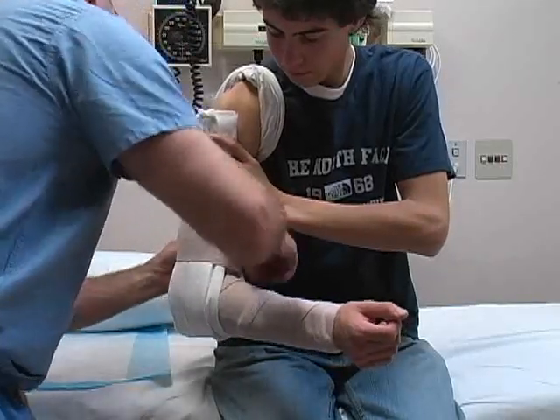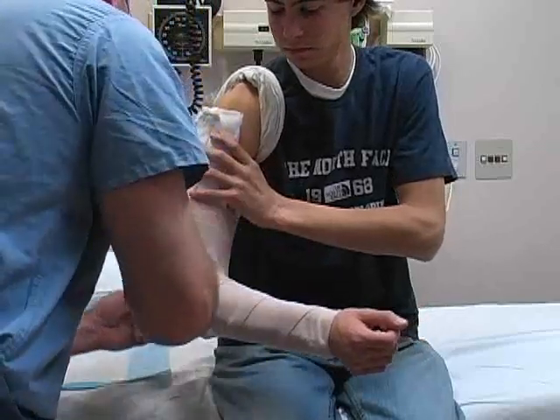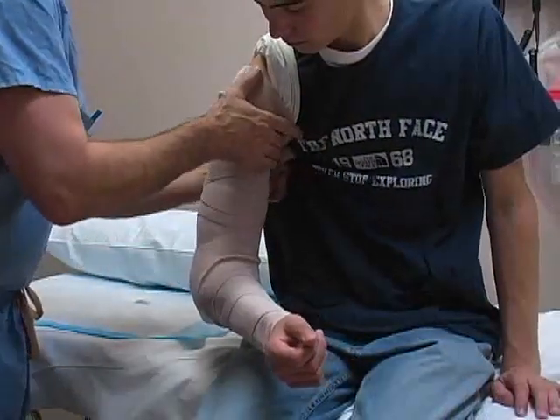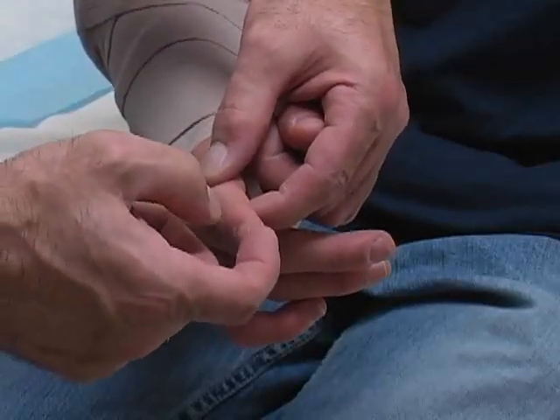Once the splint has been applied, wrap a four or six inch elastic bandage around the splint, proceeding in a distal to proximal direction. Use a moderate degree of tension while applying the elastic bandage. Recheck the distal neurovascular function once you have finished.